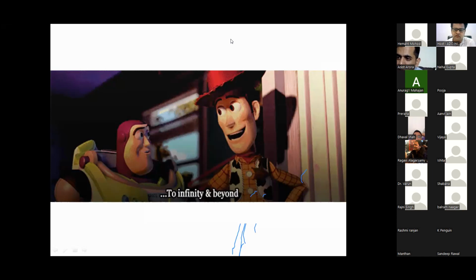So in that scenario, you need to lower the buccal bone level, so that your fulcrum can be used again. You can apply your elevators and luxate the tooth slightly. Make sure you do not luxate the adjacent tooth. The moment it is luxated, you can either use forceps or deliver it with the help of your luxators.